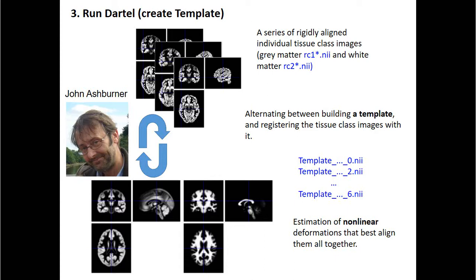I don't mean that it is the only way to do it. I just firmly follow the guidelines and the instructions. But also here, I think the goal is different. Here, you want to estimate the gray matter and then compare across groups. So I think you are looking for a normal distribution, right? When you do that. So I think the goal is different.